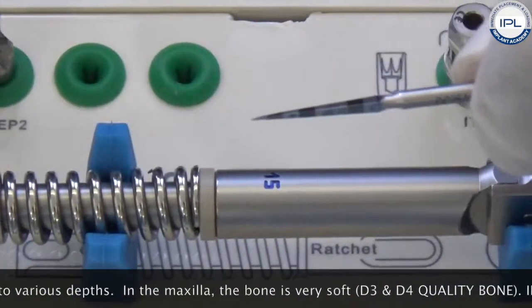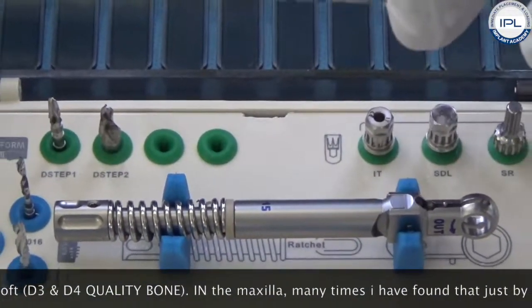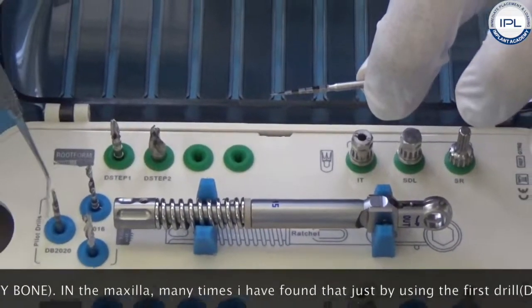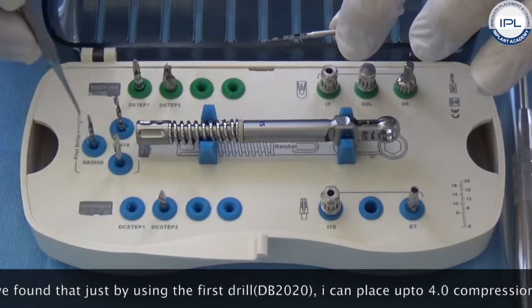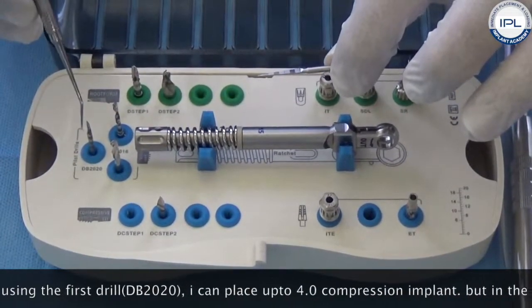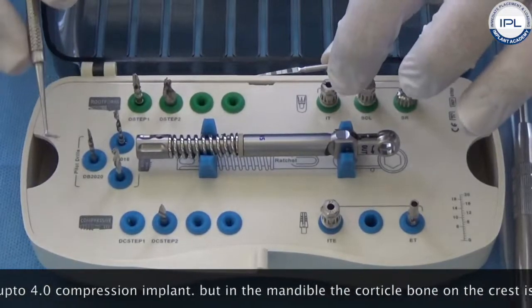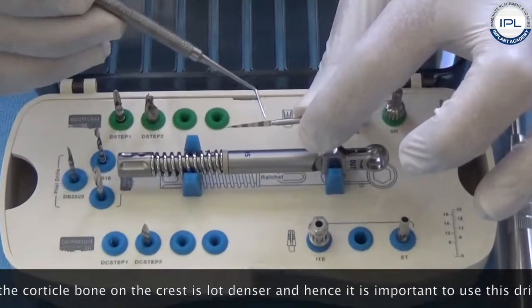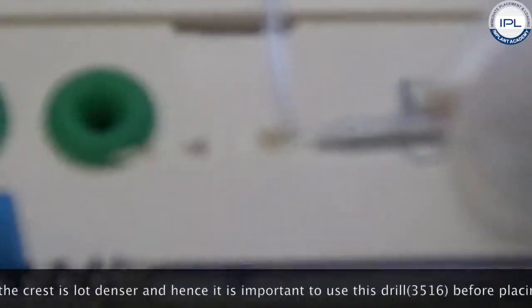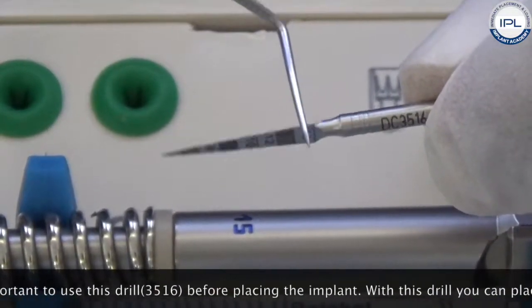It has laser markings corresponding to various depths. In the maxilla, the bone is very soft — D3 and D4 quality bone — and many times just by using the first drill I can place easily up to a 4.0 compression implant. But in the mandible the bone is a lot denser, so it is important to use this drill before placing the implant. With this drill you can place the compression 3.5 and even 4.0.